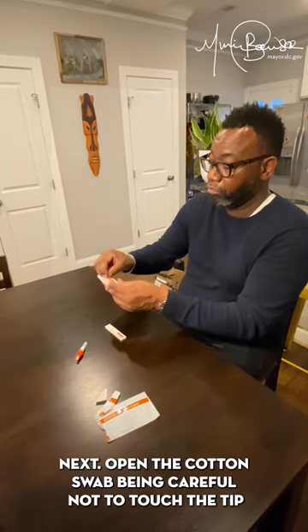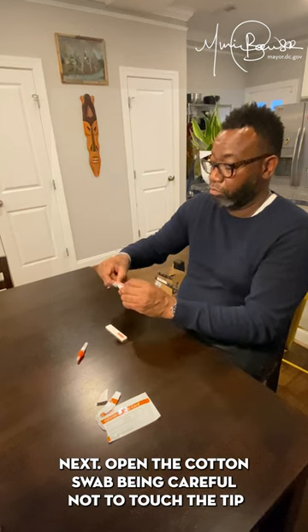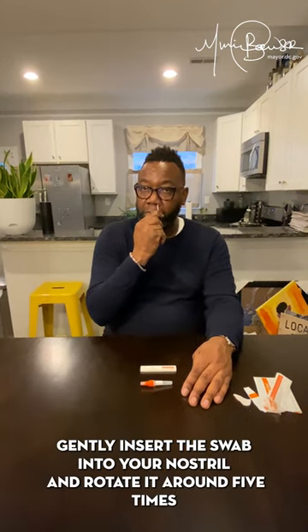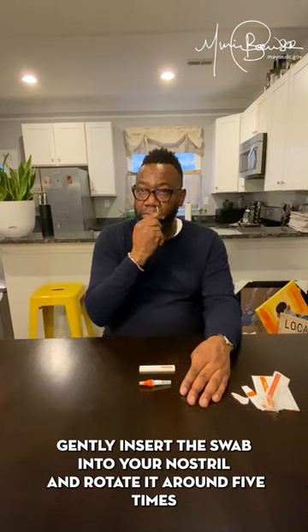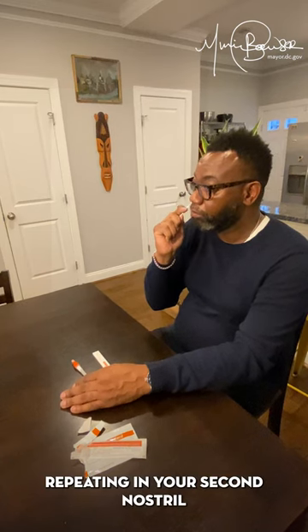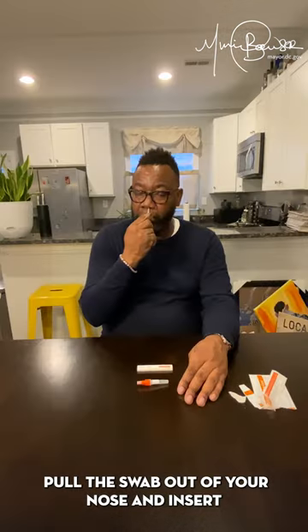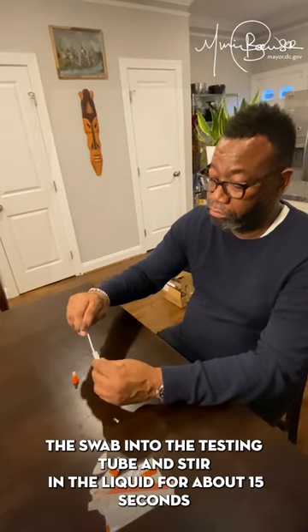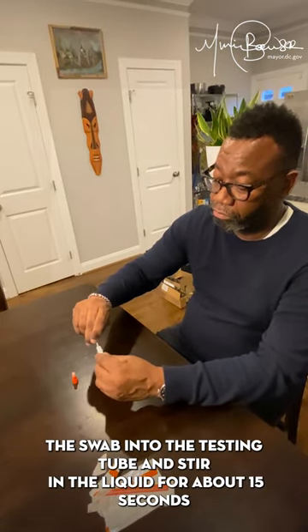Next, open the cotton swab, being careful not to touch the tip. Gently insert the swab into your nostril and rotate it around five times, repeating for your second nostril. Pull the swab out of your nose and insert it into the testing tube and stir in the liquid for about 15 seconds.